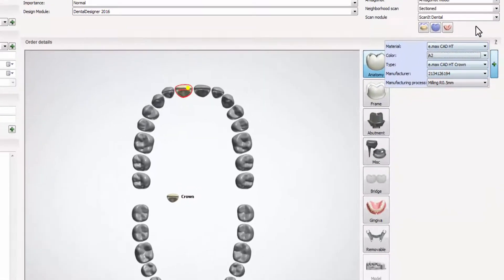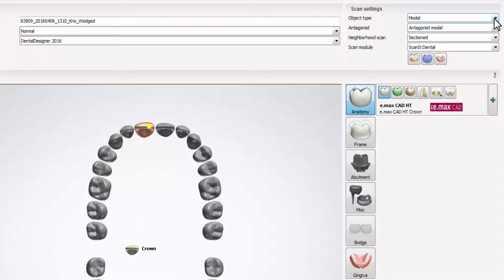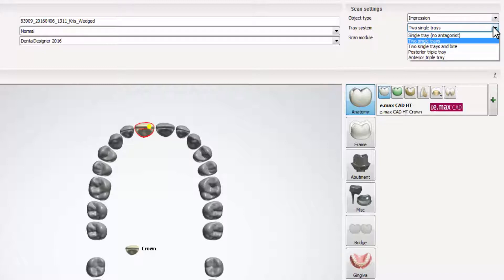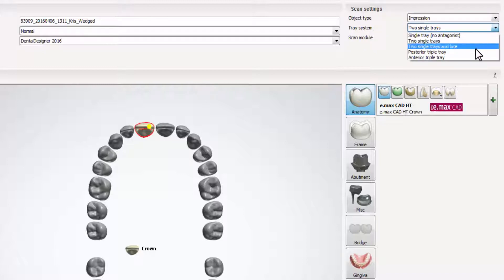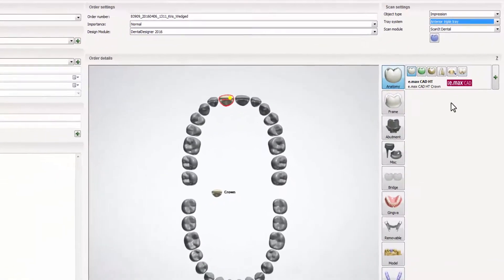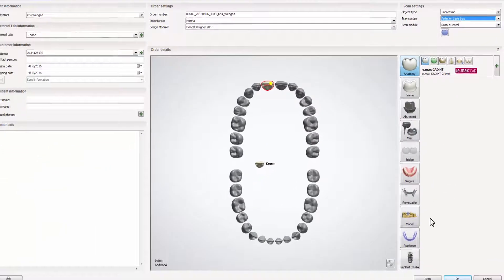Then, in scan settings, change object type to impression and in tray system, select the triple tray type. You can choose between the anterior or posterior type. In our case, we will use anterior.